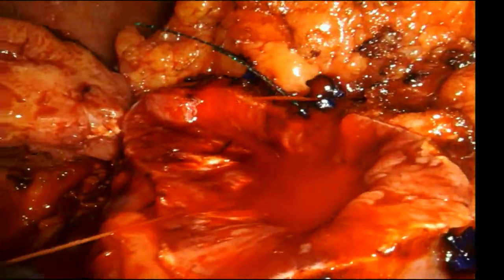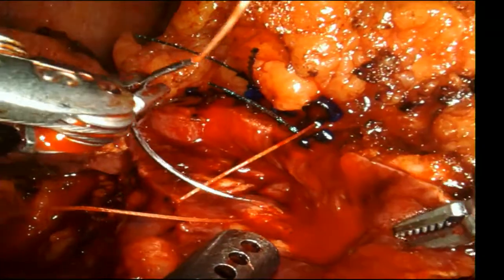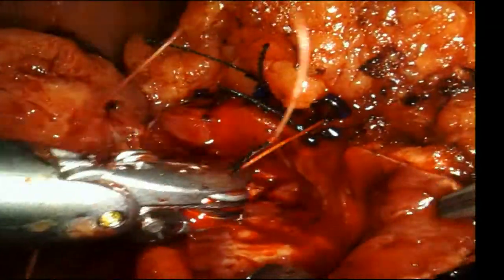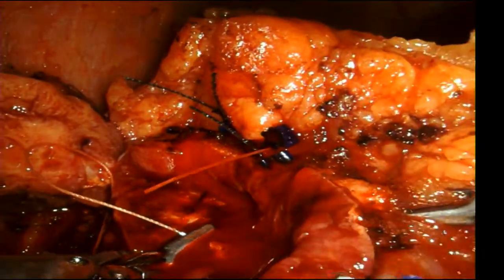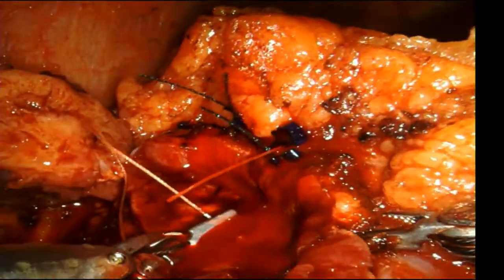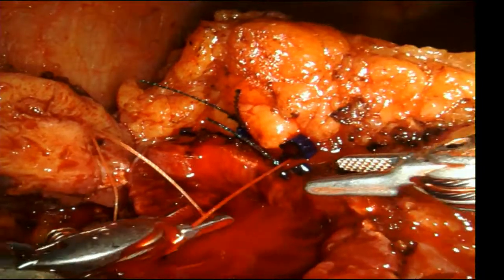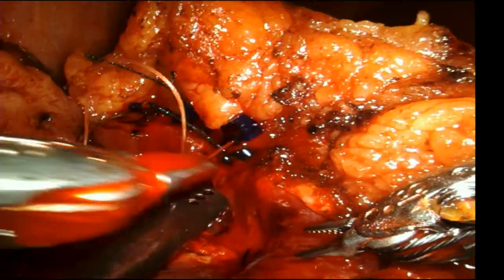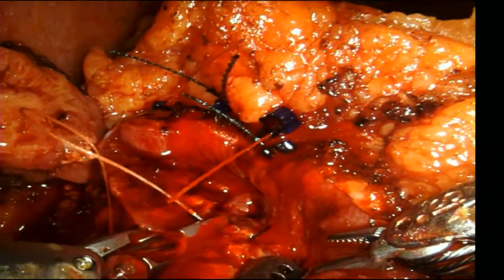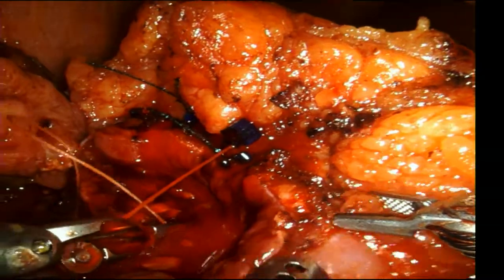And I'm going to share with you my secret weapon, which some people like, some people absolutely hate. It's my stitches that I use for the capsular reconstruction. Second there again for me for a second. Come on, stitch, reach.